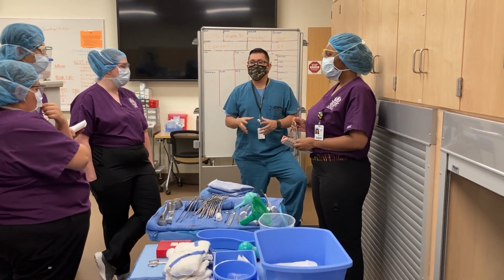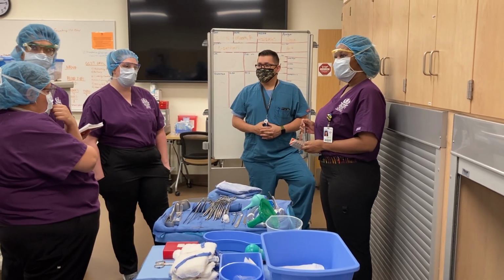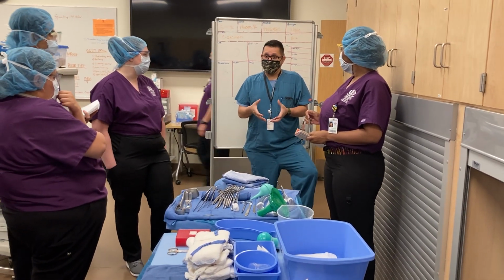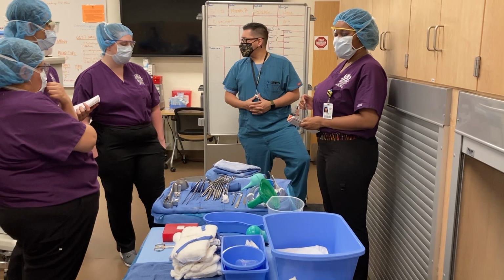Why would we not use a self-retaining retractor? Because there's too much pressure on it. There's a baby, and you have to bring it through metal. Right? Metal's not going to stretch. Metal's not going to bend. Okay, so we need a lot of handheld during the C-section.